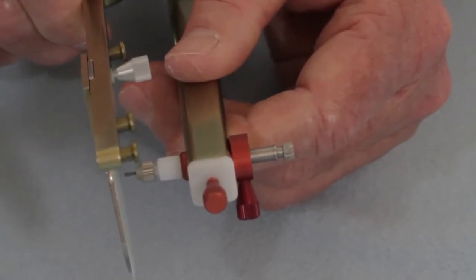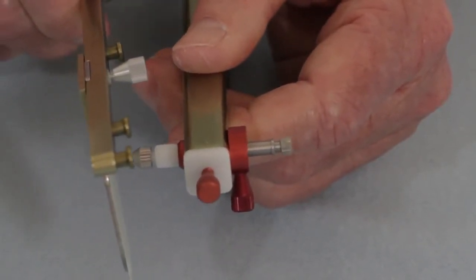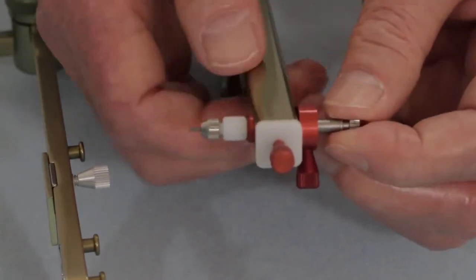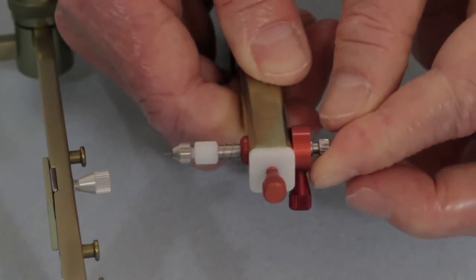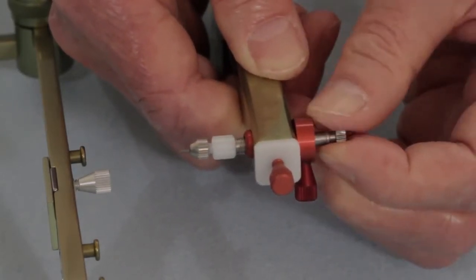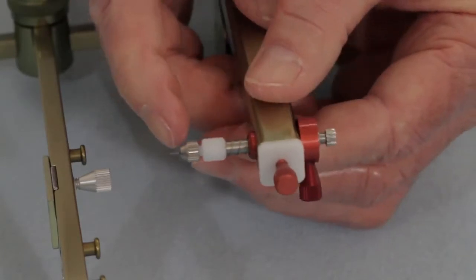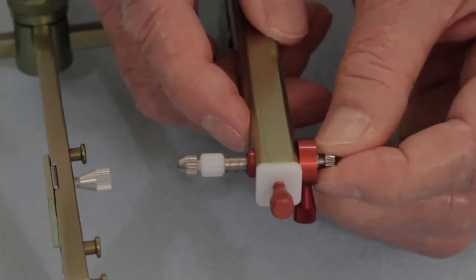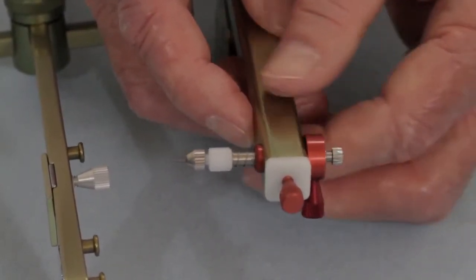And what we have to do is release the spring assembly so that the lead will go against the flag, and then it will record the movement patterns of the patient. But to release this spring assembly, you want to actually hold it and then let it go very slowly in and touch the flag. If you just loosen it and release it like that, you may break the lead. So you want to just hold it, release it, and let it move in slowly. Now as the patient moves, the spring assembly will keep the lead against the patient. It'll be moving in and out with the patient's movement pattern. And that's the way the writing pencil will work.